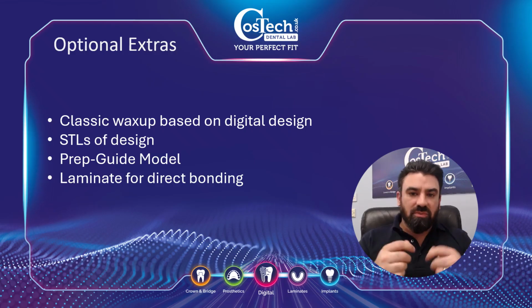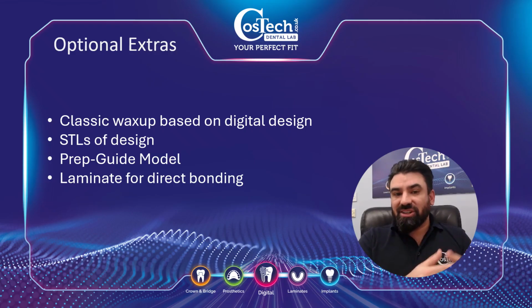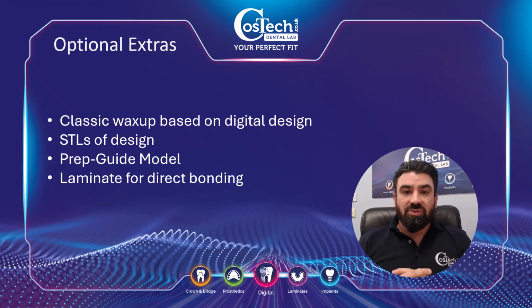You do the first one, which will block out every other tooth with enough room to put the flowable composite in. Once that's in, you then put in the second one. Because we already know what the first one has done, the second one fills in the other alternate teeth. Gives very good separation, a very good end result.